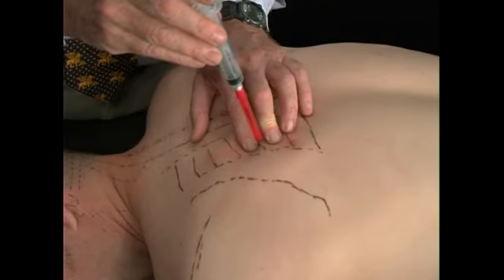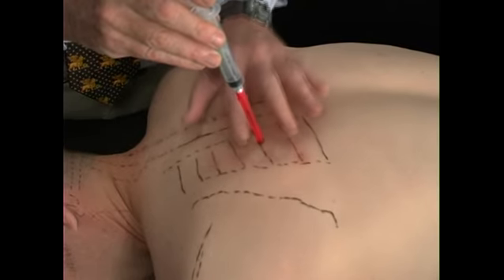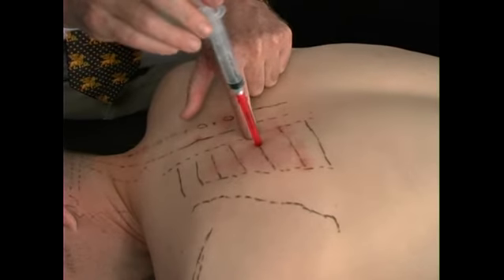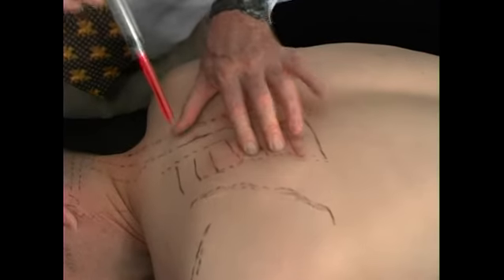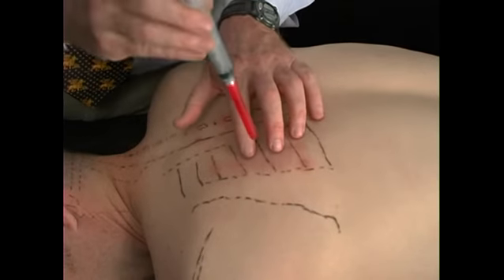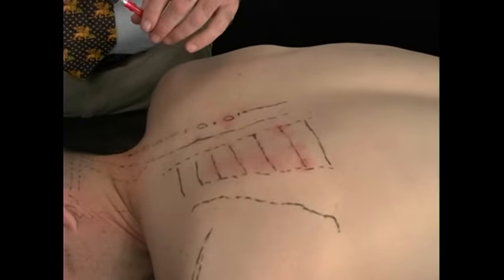And then you have to remember, though, that you've skin slid across. So I'm going to keep my needle right here to where we are, and I'm going to let the skin go, and we'll see how far over we were. So you can see that we started out here. We're now almost over to the rib transverse process junction using a skin sliding technique. When people are starting out with prolotherapy, I recommend just bringing your needle out, going back in and re-injecting, doing multiple sites. I think it's less confusing and easier to learn in that fashion.